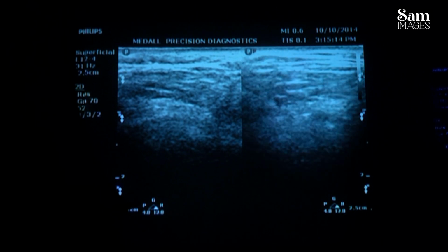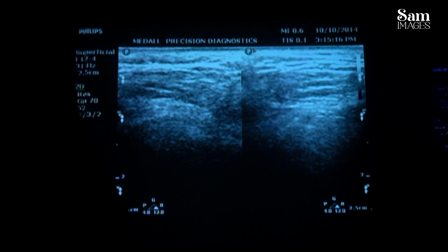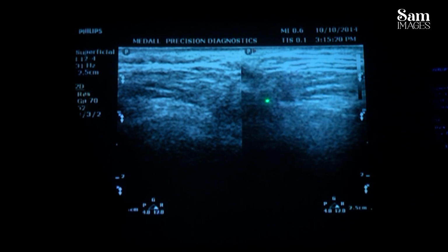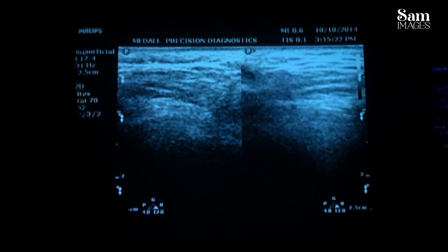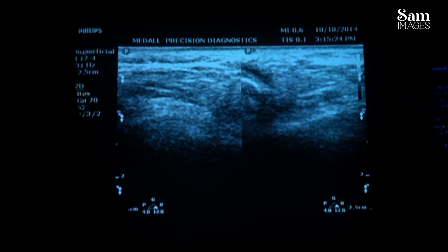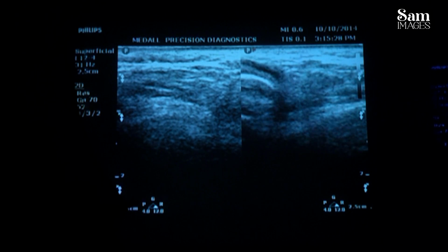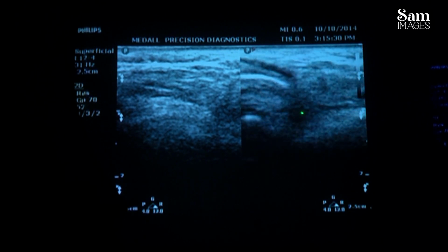You see that irregularity of the contour, that's the bone, the mandible, and the disc space also is very much reduced. This is bony ankylosis, causing this temporomandibular joint bony ankylosis.